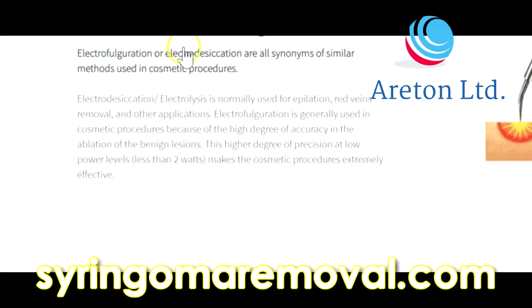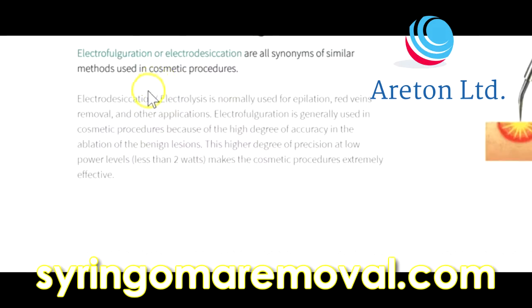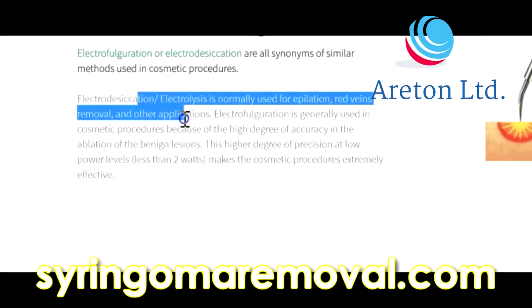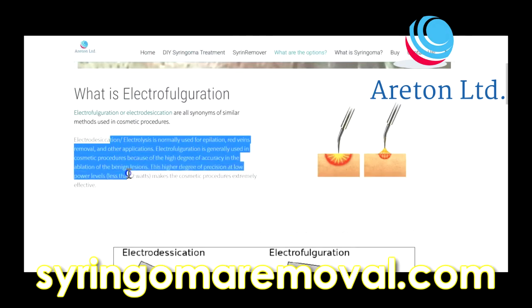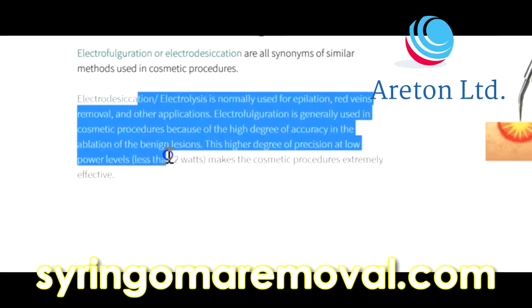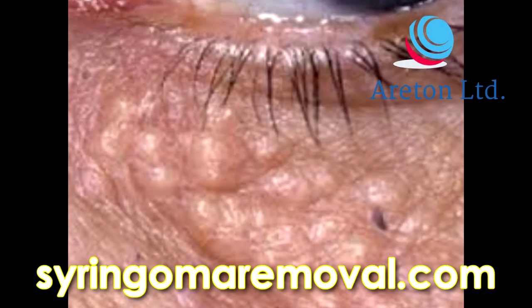Electrofulguration and electrodesiccation are synonyms of similar methods used in cosmetic procedures. Electrodesiccation and electrolysis are normally used for epilation, red vein removal, and other applications. Electrofulguration is generally used in cosmetic procedures because of the high degree of accuracy in the ablation of benign skin lesions.